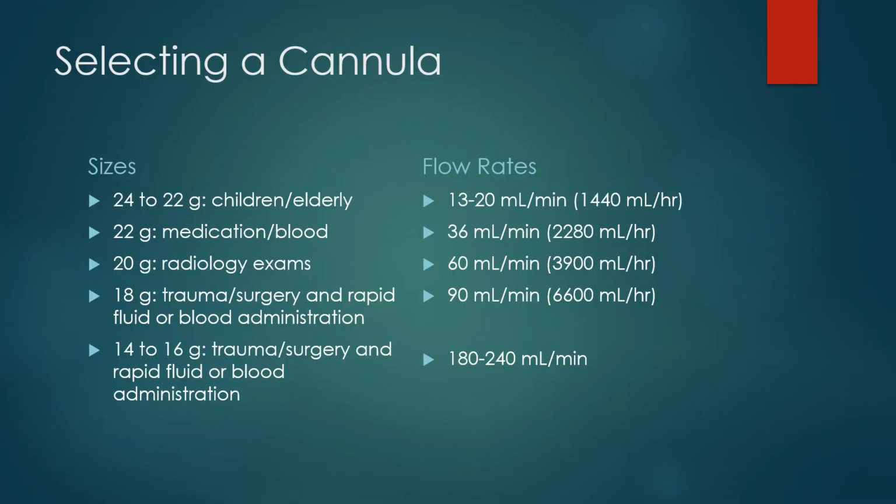So I like this slide because it really breaks down the size of the needle and just how much fluid it can tolerate. The only thing to consider again is that viscosity or thickness of the fluid or medication that could alter this just a little bit here.